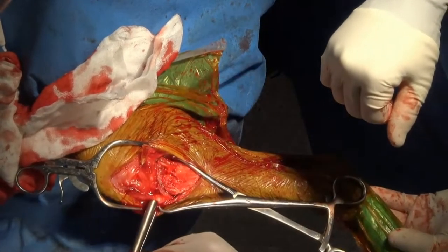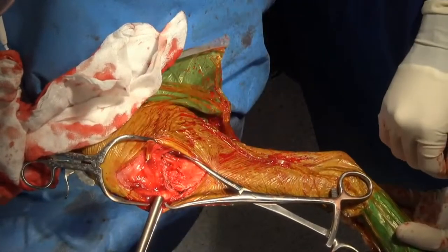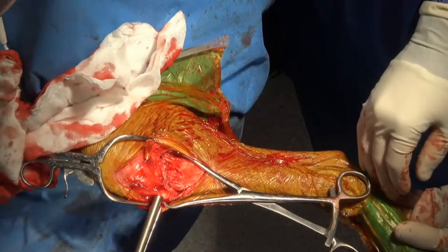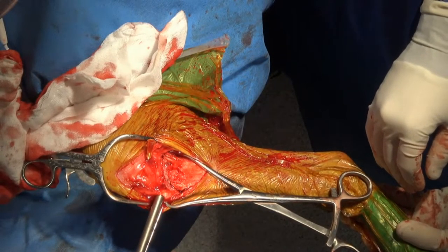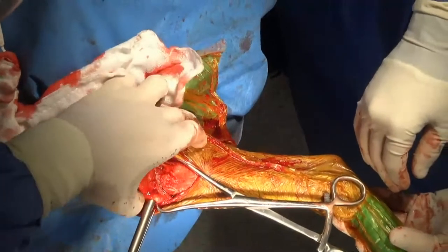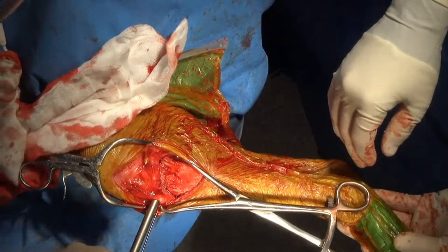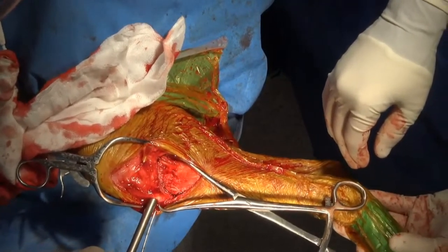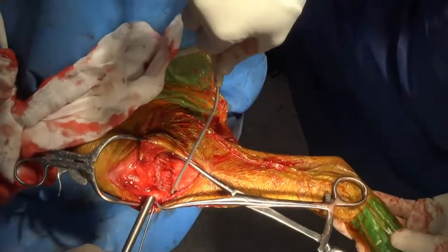And then I've got some lines on here, which you may not be able to see. So green, yellow, and red. And what they mean is as I'm tightening this, as the green line disappears, that screw is backing out. When I get to yellow, that means that the screw is just proud of the bone. And as it gets to red, it means that the screw is actually embedded right within the bone. So as I do this, I kind of have a hand on the initial compression device and we actually turn it and push that screw out. Again, keep an eye on everything there, Yui, for me.